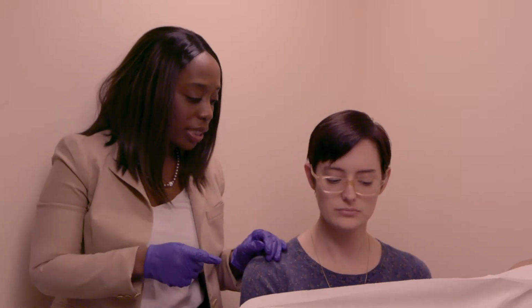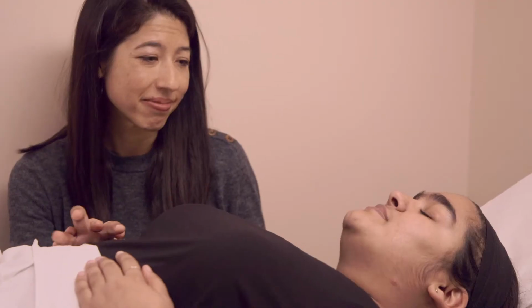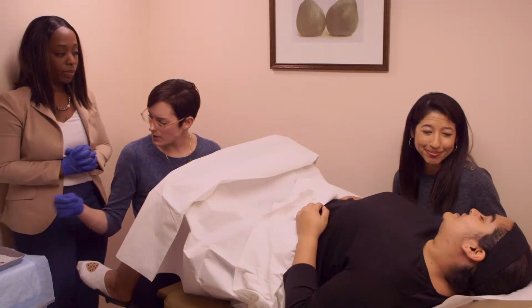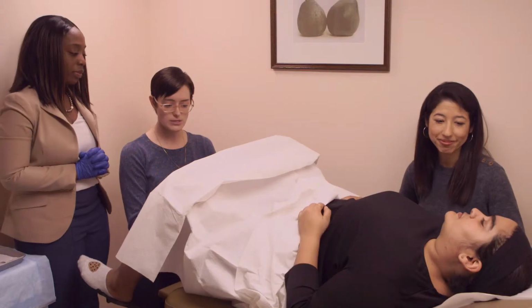This part of the procedure is similar to a pap smear. I saw you wince. How are you feeling? It's really uncomfortable. Something's pinching. Dr. Roberts can adjust the speculum. Is that any better? Yeah, that's much better. Thank you. Okay, so now I'm going to use an instrument to help hold the uterus still during the procedure.